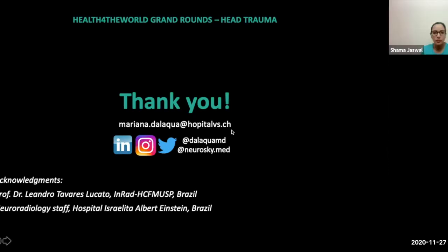Okay. So what's the role of DTI on head trauma? Well, DTI absolutely has a research role, and we see a lot of publications about it. But in all the institutions where I have worked, we don't do it routinely for head trauma because there is no data that would support the clinical utilization of FA, of fractional anisotropy, in clinical practice. So as long as there's no database for that, I don't feel comfortable utilizing that in clinical practice yet.